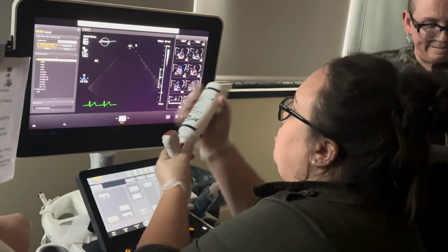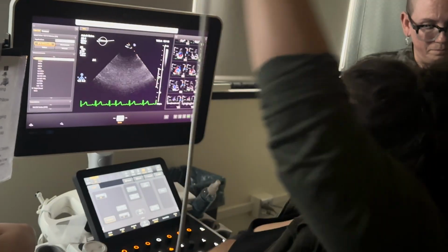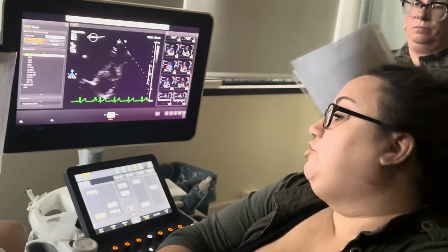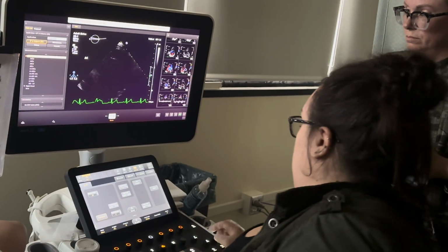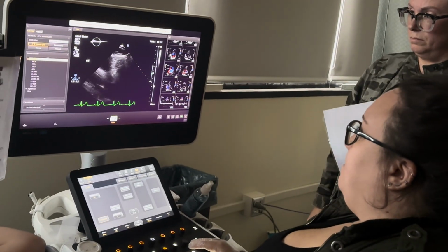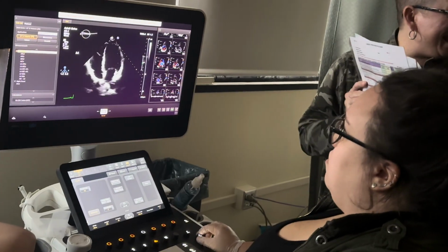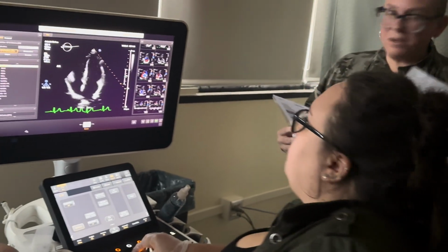All right, let's do an apical 4. Then I'll do VTIs in this one. Okay. And there's no measurements on this one. Not this one, but I am going to show you some because I think you do have some for the proficiency. Lean back a little bit for me. I think she said for proficiency we have 3 measurements. Yeah, I think so. She's so prepared.